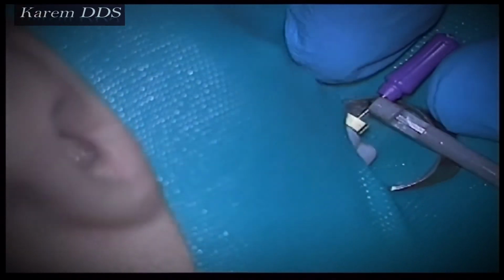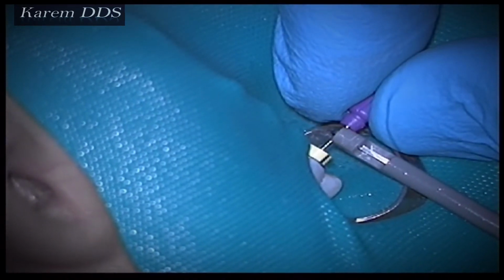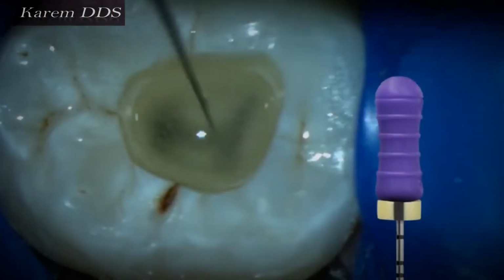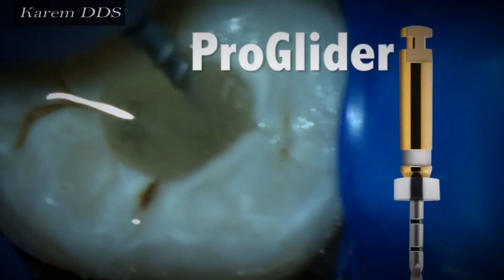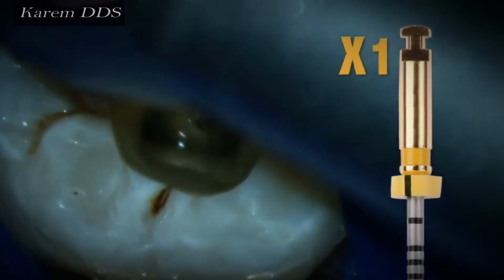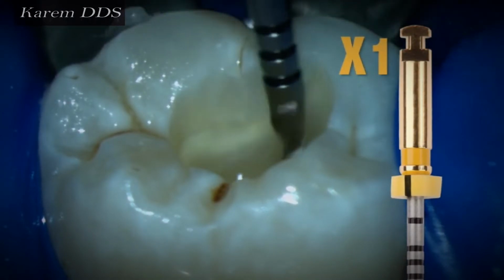Root canal instrumentation. Root canal instrumentation begins after a straight-line access cavity has been cut to allow direct access of the instruments into the root canals, and the orifices of the root canals have been identified. The next step is to instrument the root canals. The instrumentation process can be simplified by dividing the procedure into a series of steps.